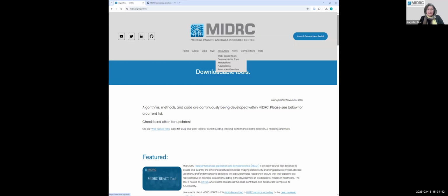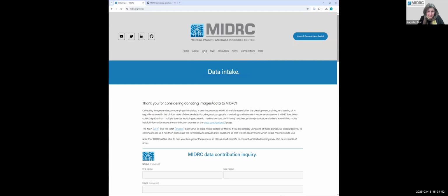Let's see, if we go to midrc.org, and let me share the screen. Oh, you did it already. Oh, you did it. Great. The data contribution page is under data. Yeah, thank you.